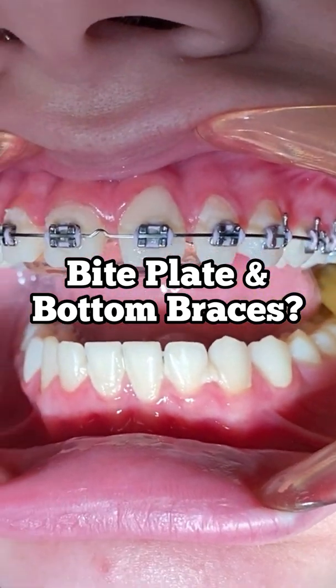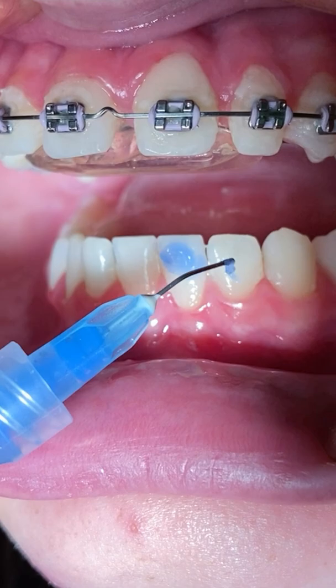Hey everyone, this is Abby, your hygienist here at Tooth Time. As you can see, we're putting brackets on the bottom of this patient's teeth.